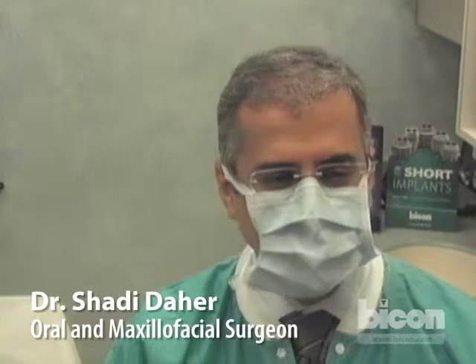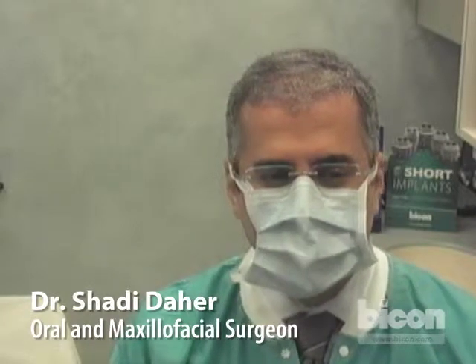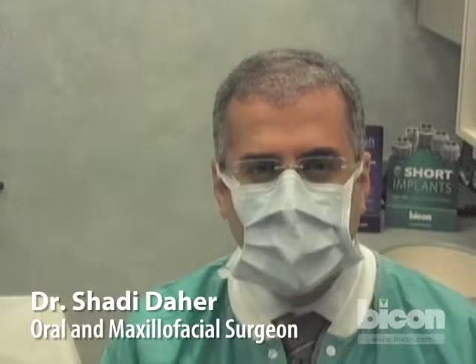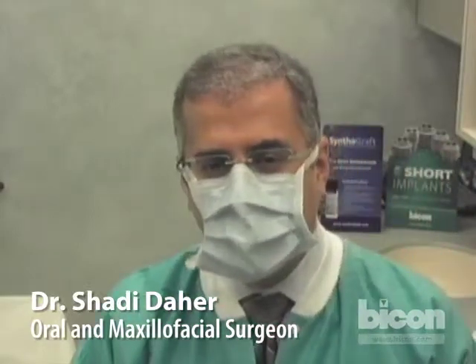I'm an oral maxillofacial surgeon, and this afternoon we will be placing an implant in the location of the maxillary right first bicuspid in an area where the buccal plate is deficient and with moderate proximity to the maxillary sinus. Now, what we will see, can we have the radiograph up, please?